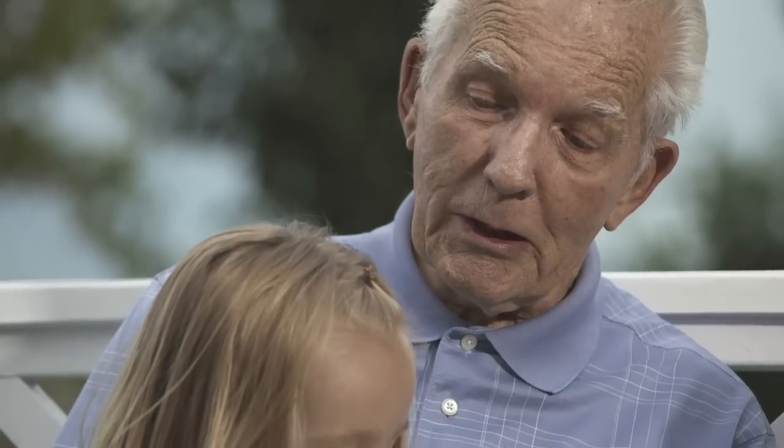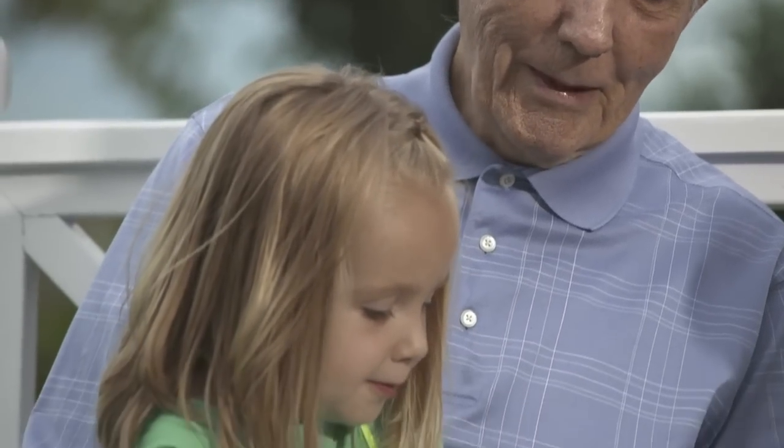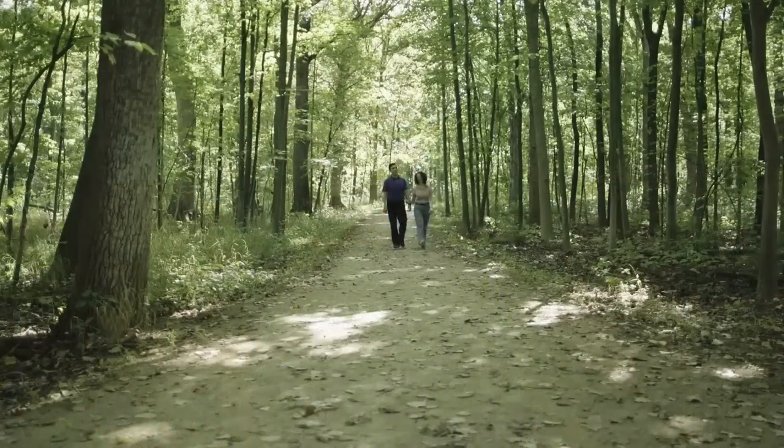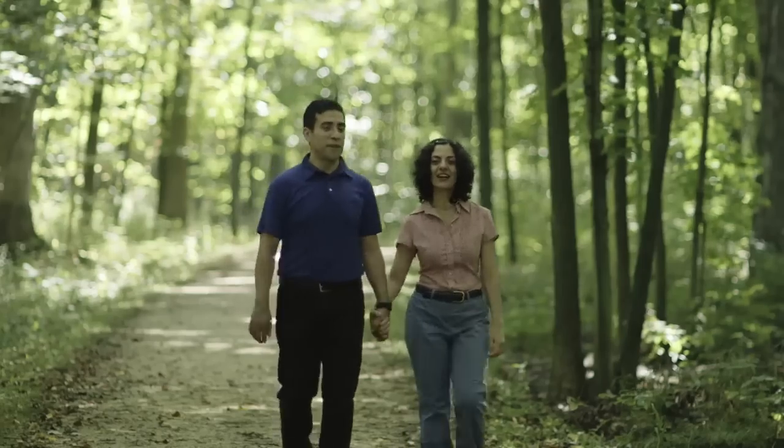The Plurex drainage system lets you drain fluid at home and on your own schedule, so you can manage fluid buildup before it becomes too uncomfortable. Using the Plurex system is easy and straightforward.